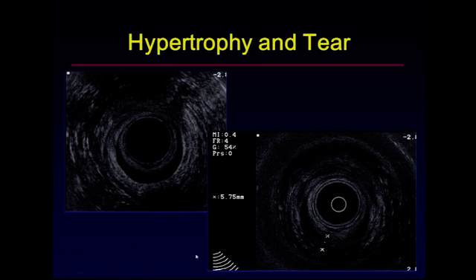And here is another patient that has somewhat complex problems, and you can see, in this patient on the left, a tear anteriorly from about 10 to 2 o'clock in the external sphincter. You can see that there's probably a tear from about 9 o'clock to 2 o'clock in the internal sphincter, though perhaps there is a strand or two of the internal sphincter present, but it's at least extremely attenuated in that region, but there's clearly marked hypertrophy of the internal sphincter posteriorly.